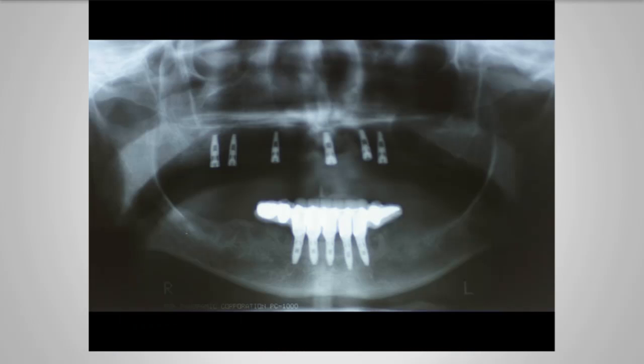Notice in the canine areas, because the implants are angled slightly more, we went ahead and used the housings that allow a little bit more angulation in the pickup. So here we see a palate-free overdenture that's metal reinforced. And looking at his Panorex, we can see we've avoided any anatomical areas that may pose a problem. We notice that the FP3 bridge in the lower arch is very stable and going strong.